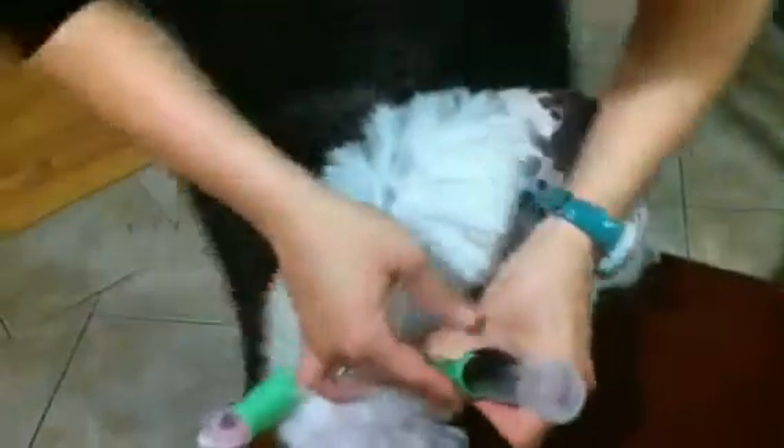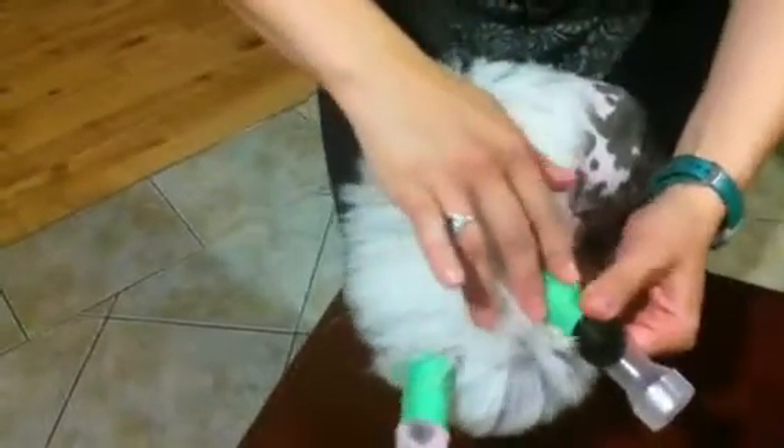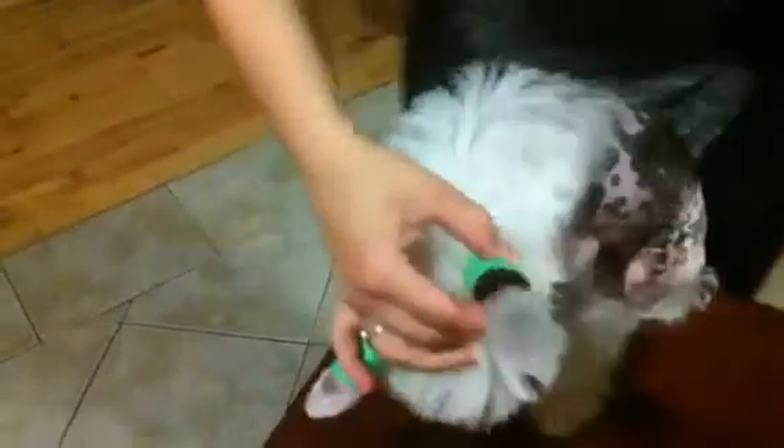Now I put the syringe back inside the ear, wrap the shorter piece of tape from the front of the ear to the syringe, and guide the other one around the back of the ear into a circle. Now you don't want to let it go yet — we need that smaller piece of tape for the lock down.